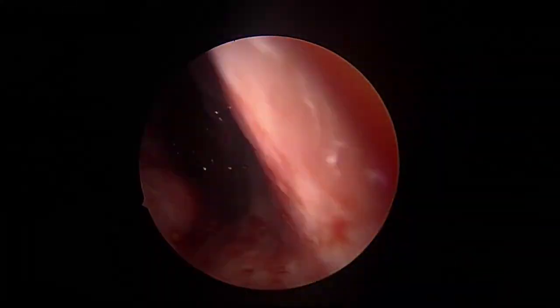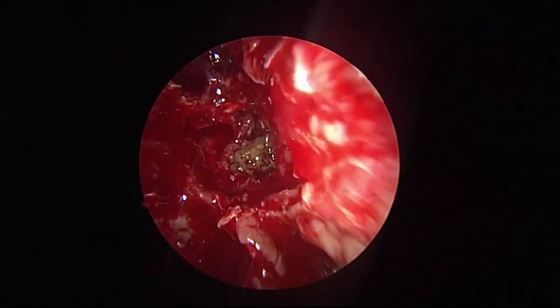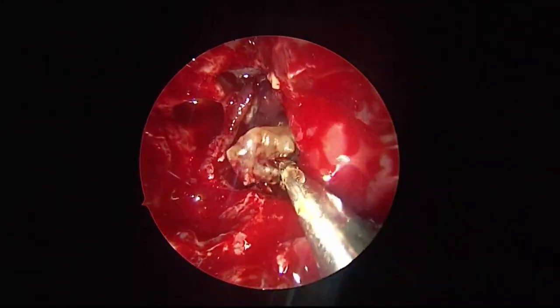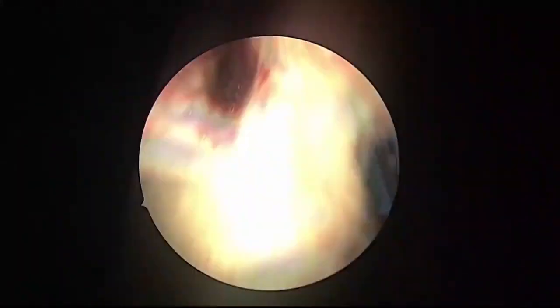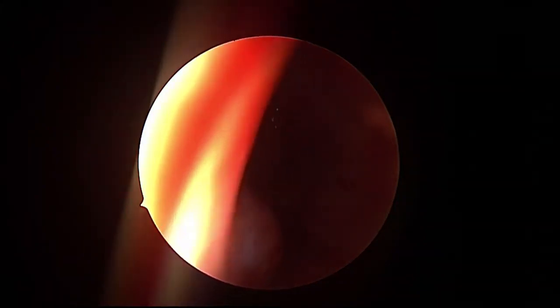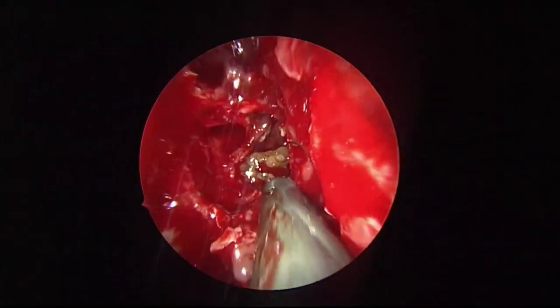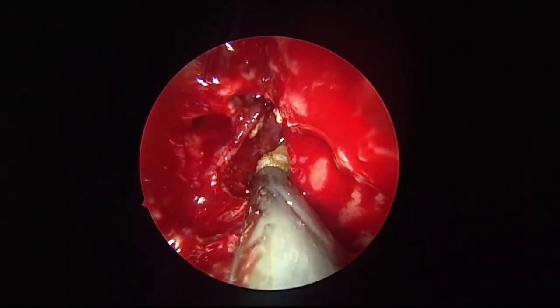Now the high power suction. I'm using the high power now.